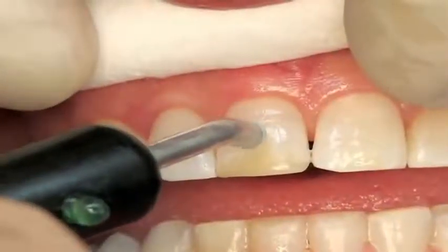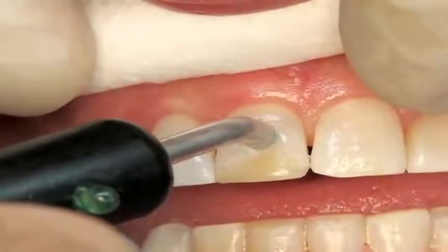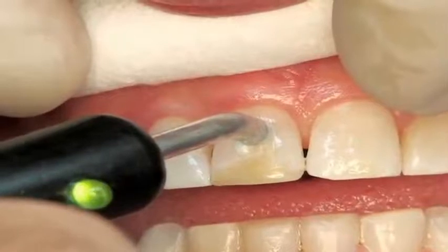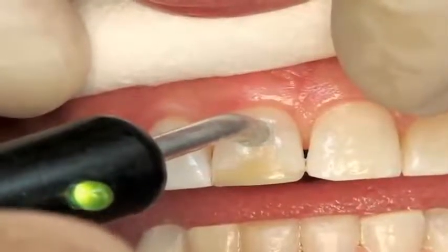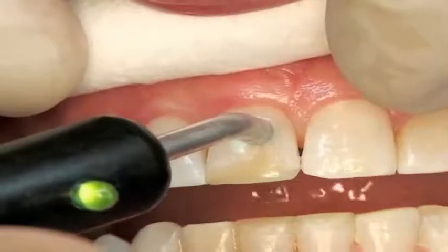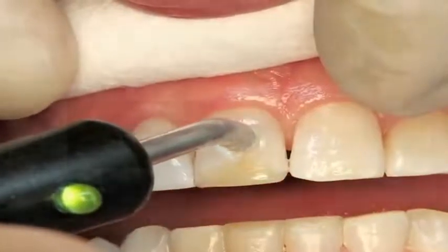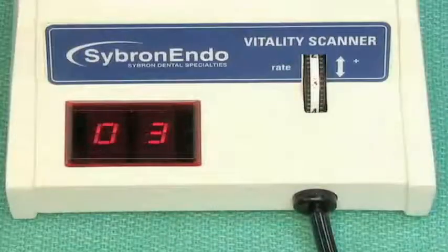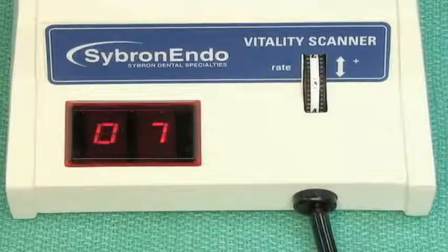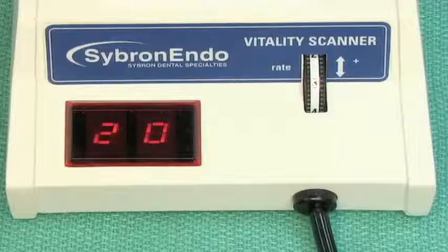Electrical pulp testing. After the suspected tooth is isolated with cotton rolls and dried, the electrode with a small amount of toothpaste is placed on the facial or lingual surface of the tooth. Using a lip clip or having the patient touch the metal handle completes the electrical circuit, and the level of current gradually increases until the patient detects it. The presence of response usually indicates vital pulp, whereas the absence of such a response usually indicates pulpal necrosis.